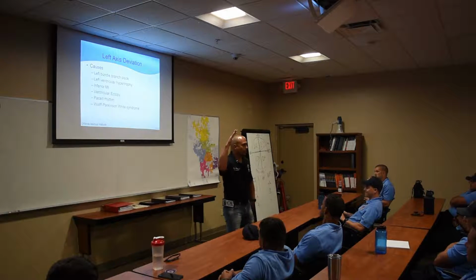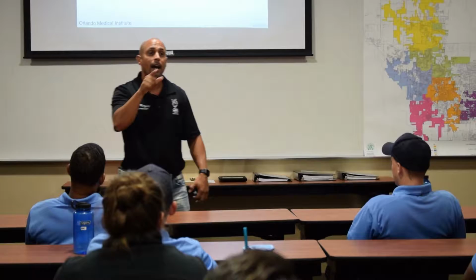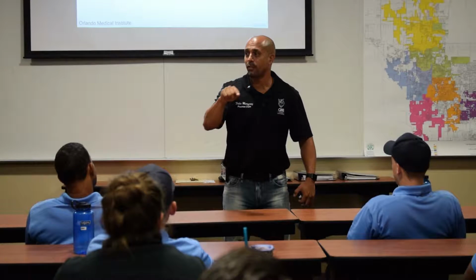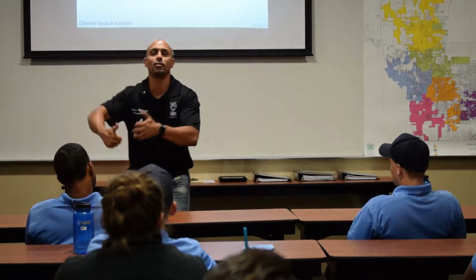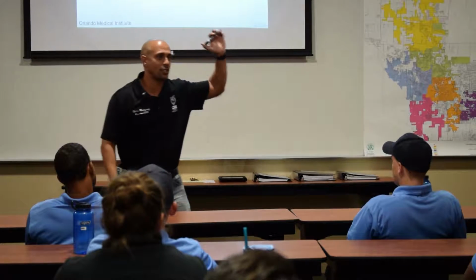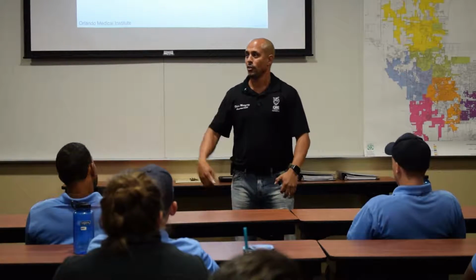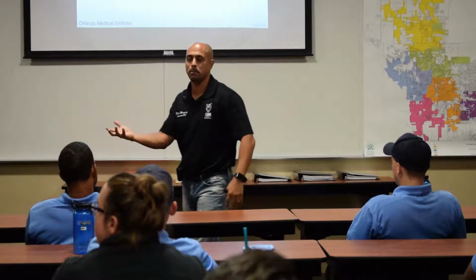So his pressure is starting to what? Drop. So you say, damn, is that a normal pressure? Did he take too much meds? I do a 12 lead. Because if I got a 12 lead with right axis deviation, that tells me that the pulmonary pressure is through the roof, but the systemic pressure is trashing, is going down. Now that's cardiogenic. You're going to have high pulmonary pressure, low systemic pressure in a cardiogenic patient.